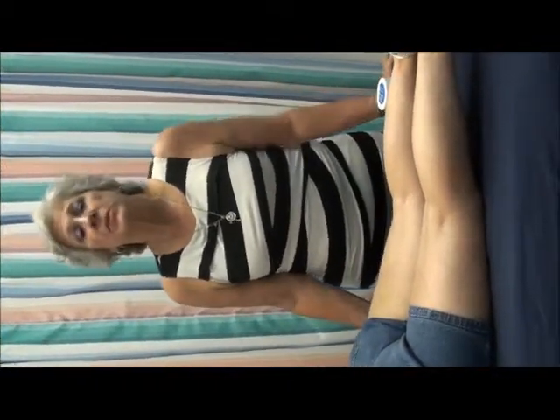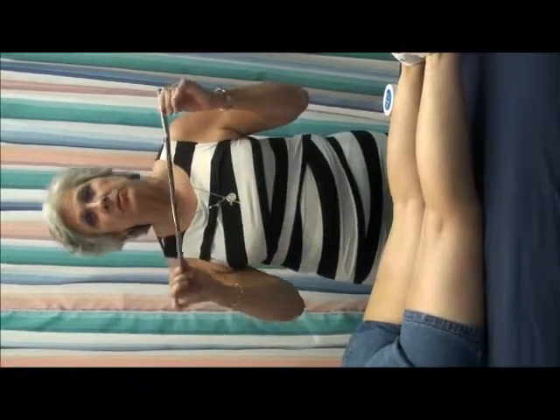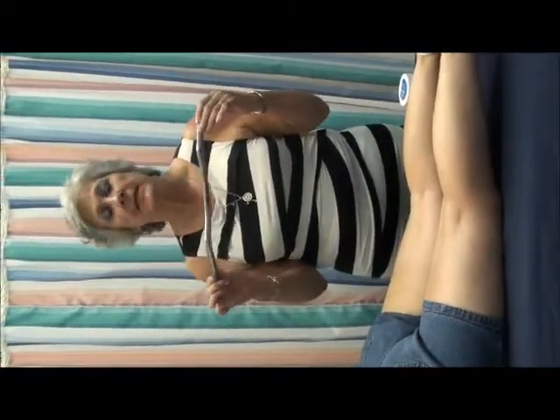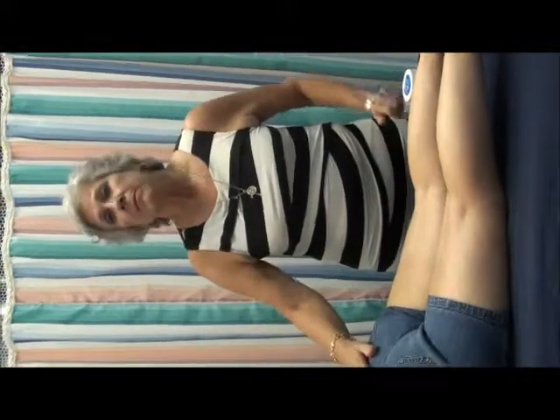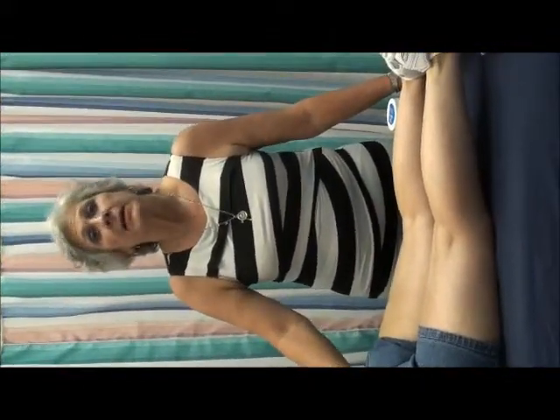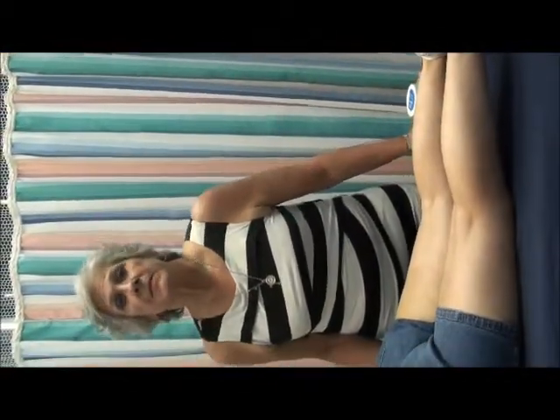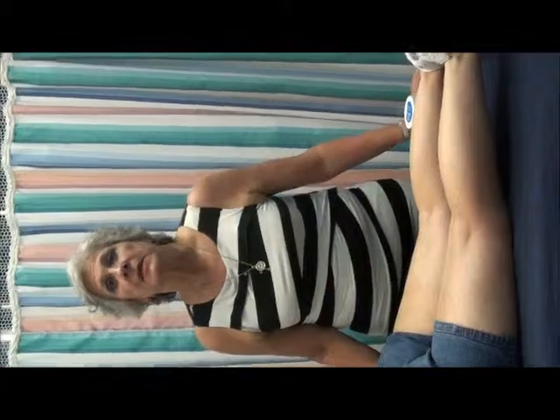Today I'm going to demonstrate Graston technique on the hamstrings. Graston technique is an instrument-assisted technique that uses various instruments to go in and break up scar tissue and adhesions in muscle. My patient here, Corinne, has had osteoarthritis in her knee for quite some time, and as a result of that, she has developed some adhesions in the muscle.